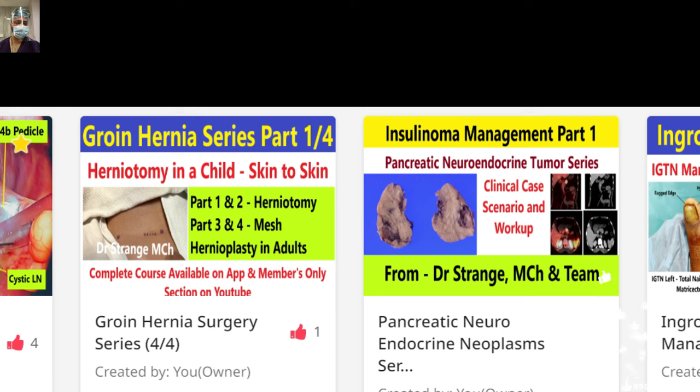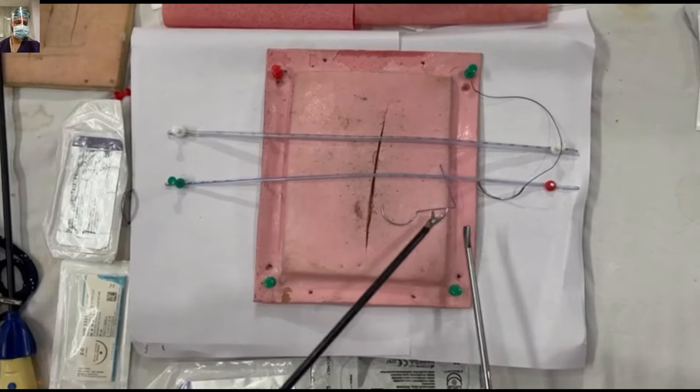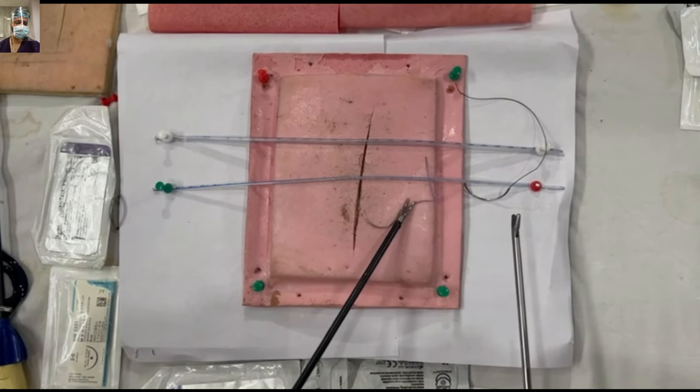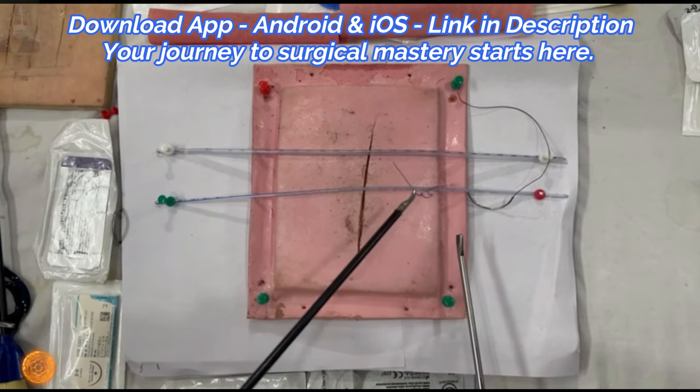Announcement out of the way, let's resume our journey. In this part, we will cover how to engage the needle in intercorporeal suturing. There will be many techniques, but as I've said multiple times before, you have to know one, practice one, and master one.